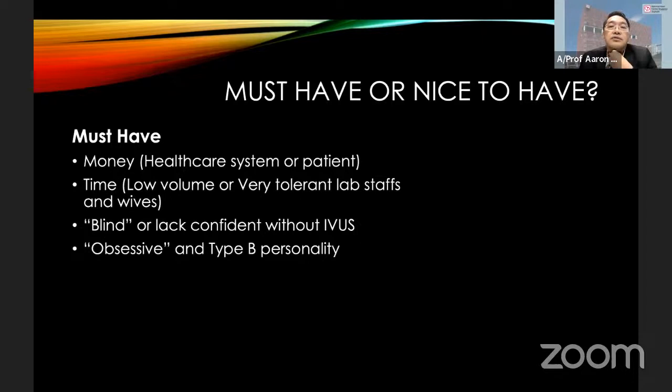So those who say intravascular imaging is a must have, basically, they have lots of money. The healthcare system may pay for it, or the patient may pay for it. And they may have a lot of time, maybe low volume, and also very tolerant lab staff and wives as well. Those who are blind or lack confidence without the IVUS just couldn't do the left main stenting normally. Some are because of personality, they're obsessed, type B personality, have to make everything pretty.